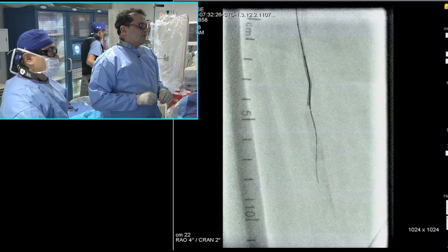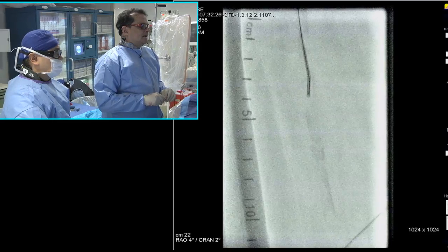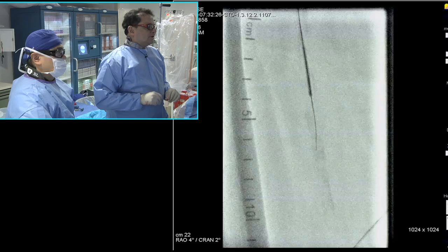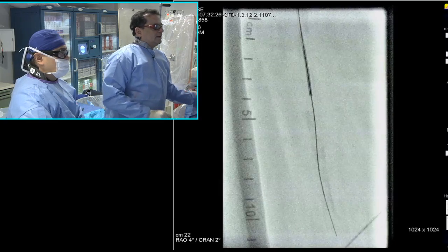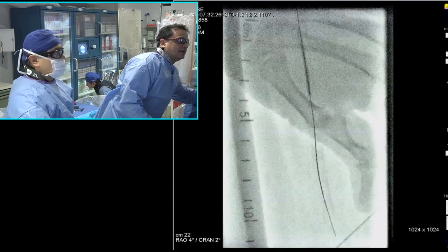I may be wrong, but I think the point here is really to talk about thrombus management in these kind of cases. Angiographically, clearly that definitely looked like there was a lot of other things other than, what is it called, atherosclerotic debris in there.